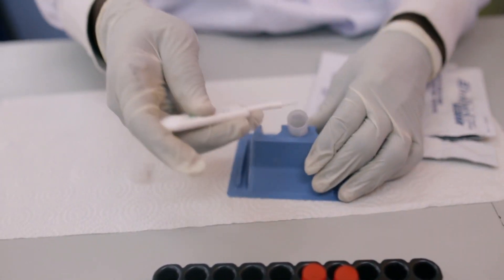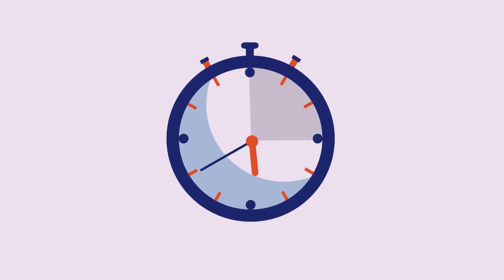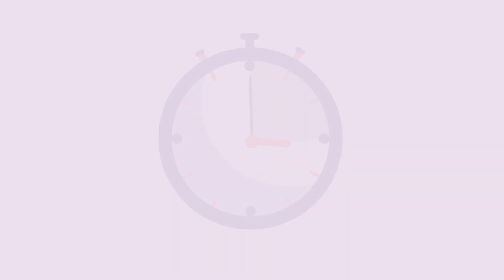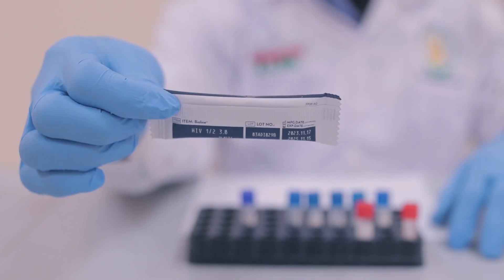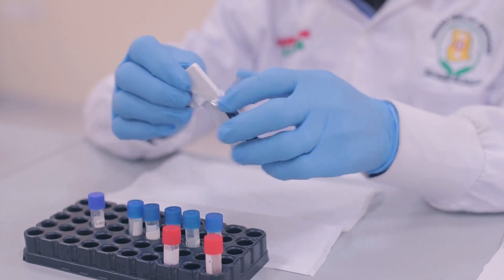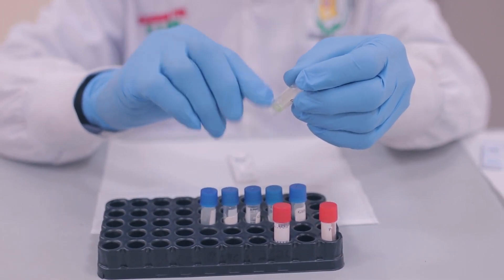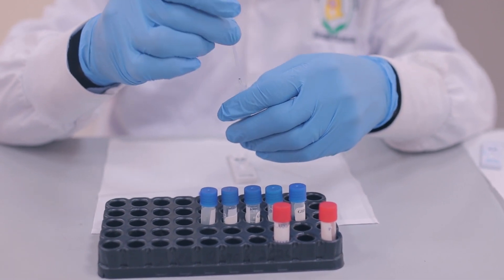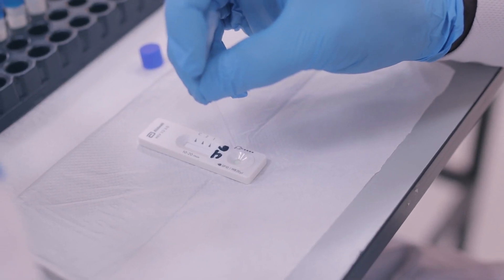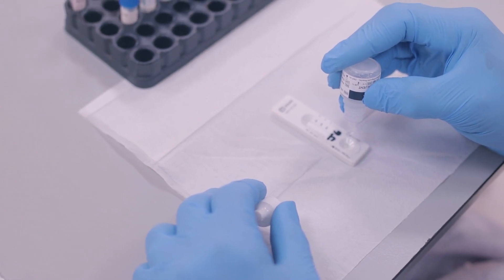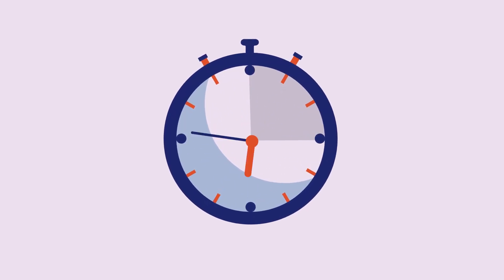Remove the pad end of the ORAQUICK, place it in the ORAQUICK buffer, and mix. Wait and time according to manufacturer's instructions before you read your results. The ORAQUICK is reactive, so we will go on to use Abbott Bioline for the same reactive sample. Check expiry date and if it is good, bring out your test kit from the pouch and label with the sample ID. Tap your sample to mix properly and with the Abbott Bioline dropper, fill to half of the black mark on the dropper. Transfer sample to the well of the test kit, add 4 drops of the Abbott Bioline buffer, and wait and time according to manufacturer's instructions before you read your results.